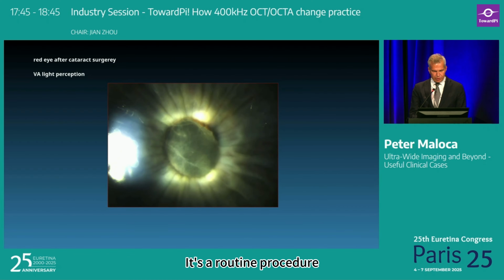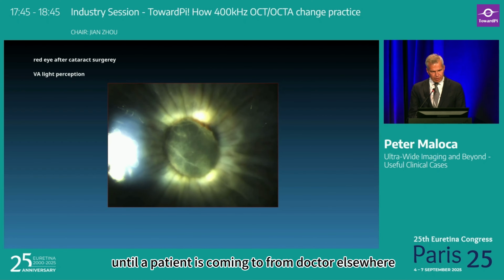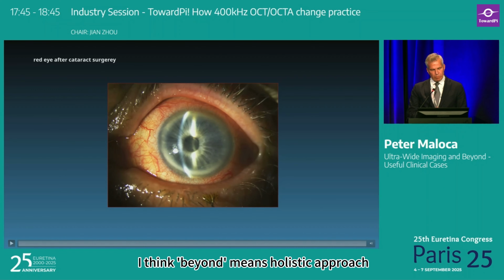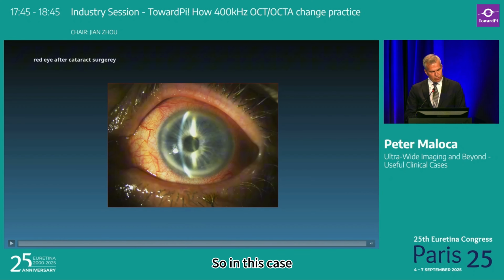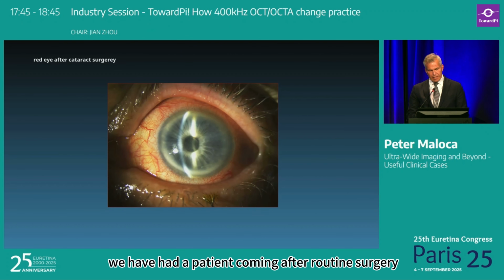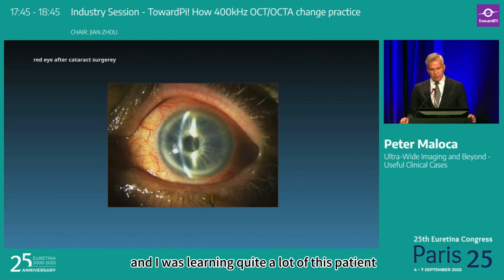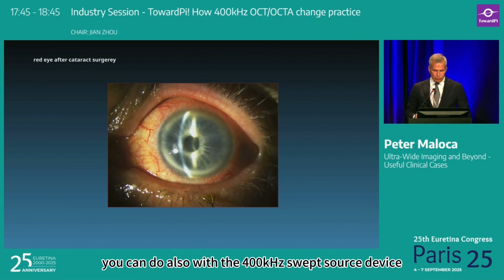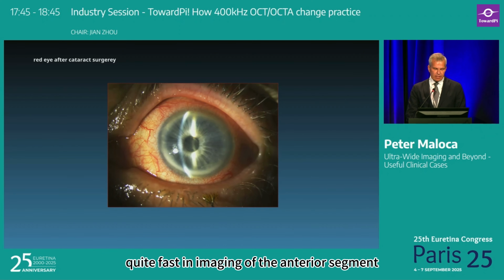Cataract surgery is nothing special. It's a routine procedure until a patient is coming to you from a doctor elsewhere, having only light perception, as you see these membranes. I think beyond means holistic approach. So in this case, we have had a patient coming after routine surgery, and I was learning quite a lot from this patient. So when you have this situation, you can do also with the 400 kilohertz swept source device quite fast an imaging of the anterior segment.